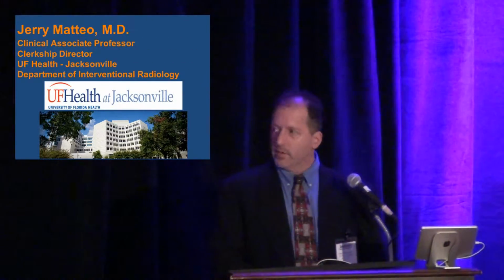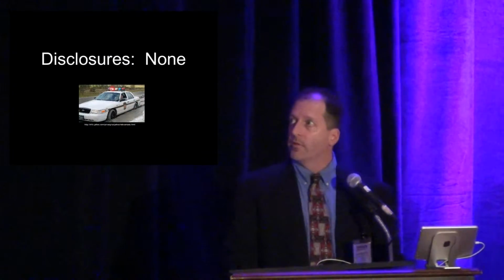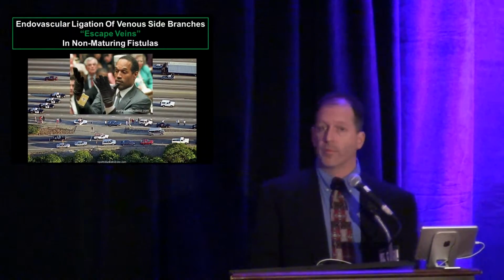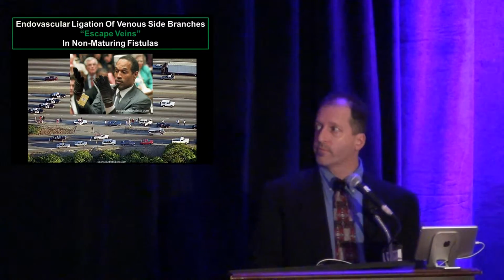Thanks for having me. I don't have any disclosures. So the title of my talk is Endovascular Ligation of Venous Side Branches, otherwise known as escape veins, in non-maturing fistulas. Everybody remembers this big escape, 1995, this guy.